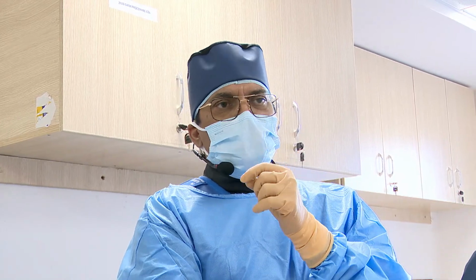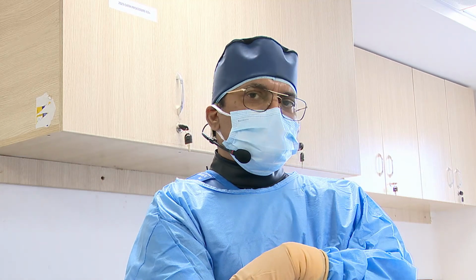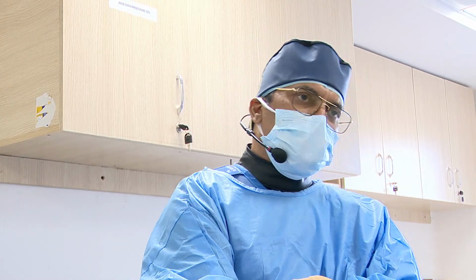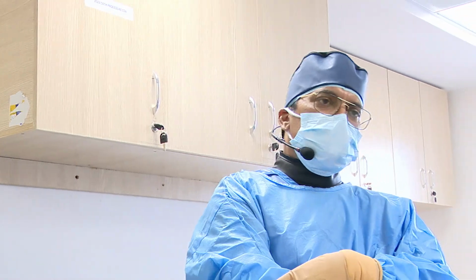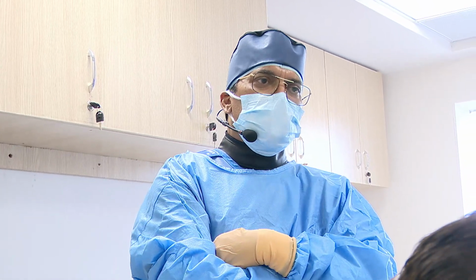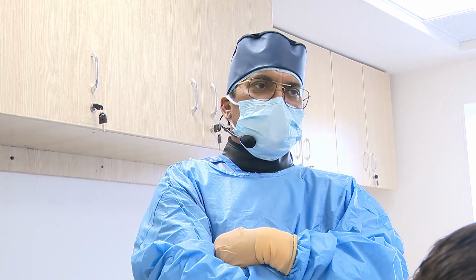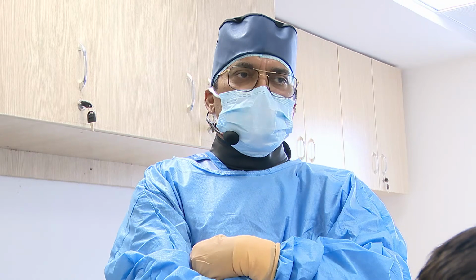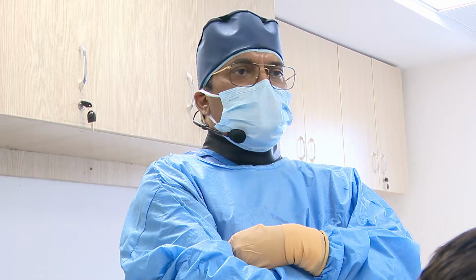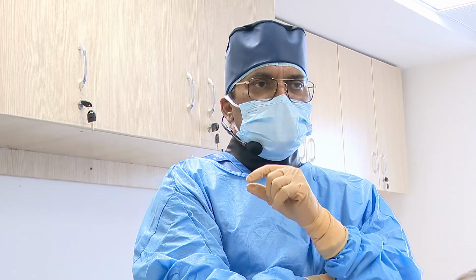Another advantage: usually in the previous version of this catheter, the marker is far behind the lens, about 2 to 3 mm. But here the imaging marker is just at the lens, wherever the marker is there. The distal marker is another advantage of this catheter. You can acquire 75 mm, so the length of the coronary artery between the marker and access can be captured very effectively.